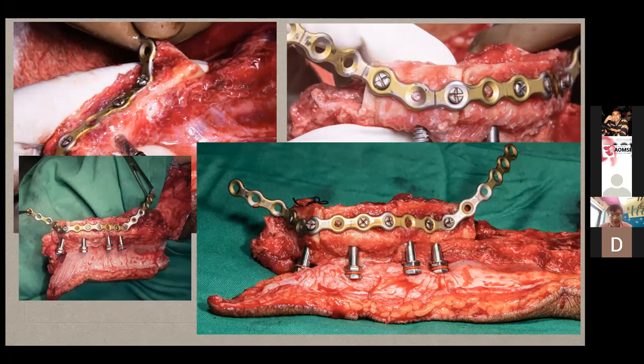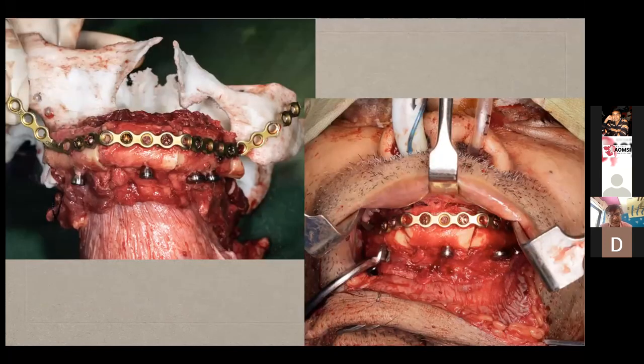Before we do that, as I said, we again check it on the model to see if it is going to be fixed well. Although while taking the picture, the implant has moved, the whole thing has moved, it was sitting right in the position passively. So we will already be deciding how many screws we'll be putting. Once that is done, we fix the fibula intraorally on both the zygomatic bones.